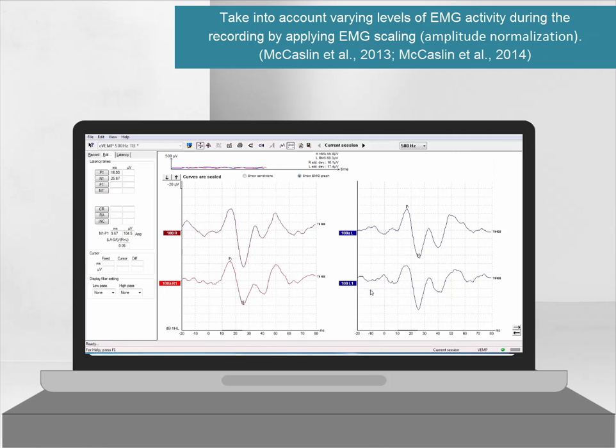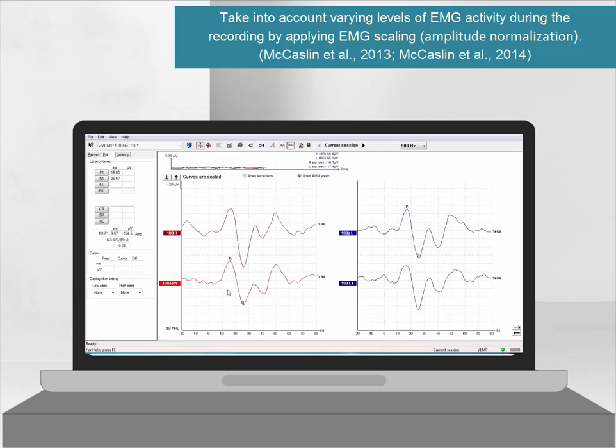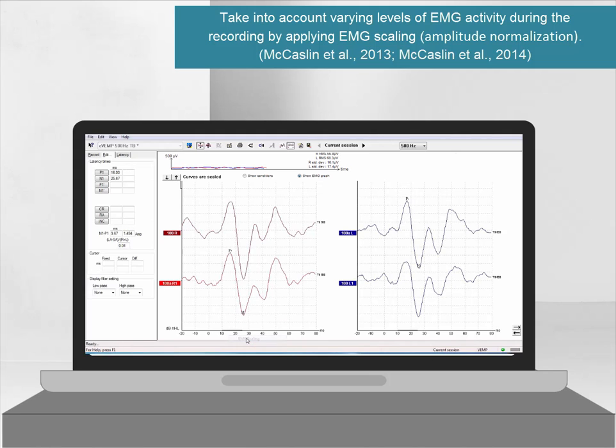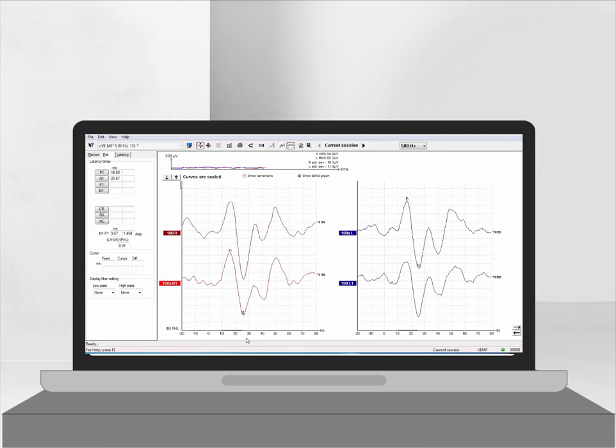As the C-Vemp requires the muscle to be contracted, it is recommended to apply EMG scaling. This method takes into consideration the average EMG values recorded throughout the collection. By doing so, this makes individual recordings comparable even if slightly different degrees of muscle tone have been applied during the different recordings. EMG scaling can be applied by right-clicking the waveform and selecting EMG scaling.